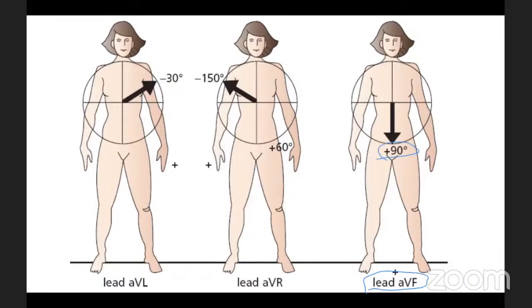Okay, guys, now we're going to move into negative angles. Why? Because which is easier? For me to say this huge thing and say positive 330, or is it easier to say negative 30? Go anti-clockwise and just say negative 30. That's a lot easier, right? Right or wrong? Yeah, it's much better to do negative 30. So we'll just do the tiny angle. We'll go negative 30 for the AVL.